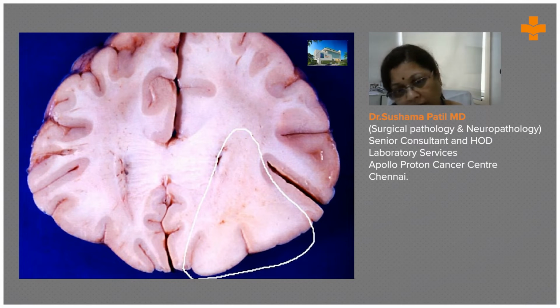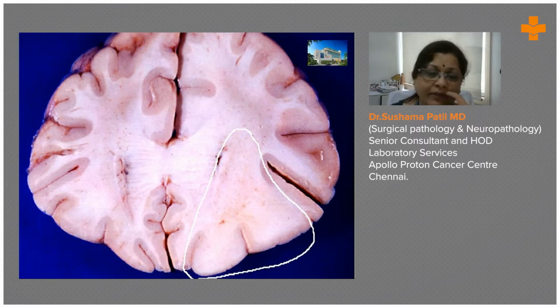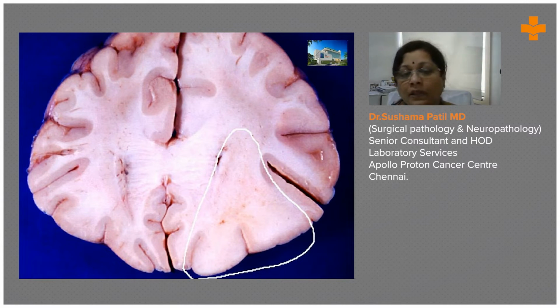On autopsy, it had already crossed, and we could see the tumor on the other side. So grossly also, when you see the tumors grossly, but still when you see microscopically, the tumor had crossed the midline and it had reached the other hemispheres. Although you cannot see in the white matter here, because I told you initially tumors maintain and respect the vascular boundary and the anatomic boundaries. So you don't see much change. Only when it becomes obvious, when it's very cellular, then you start seeing the changes reflecting grossly.